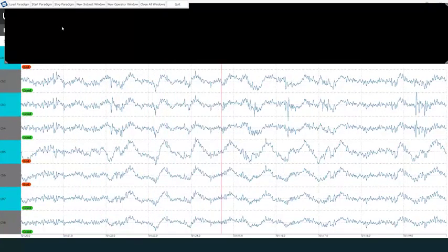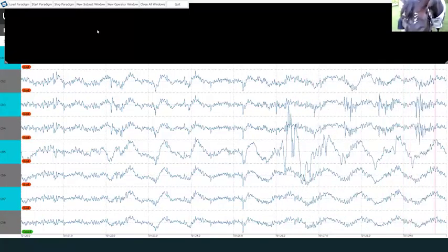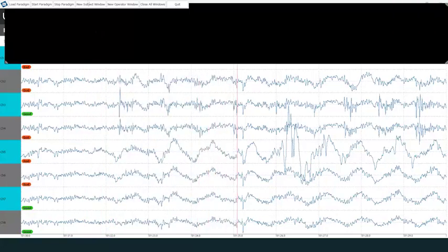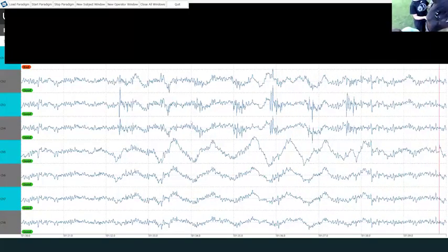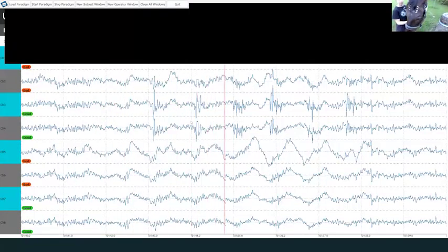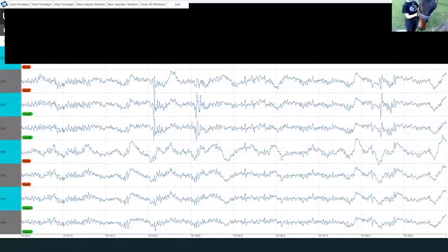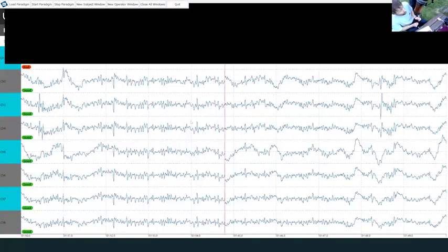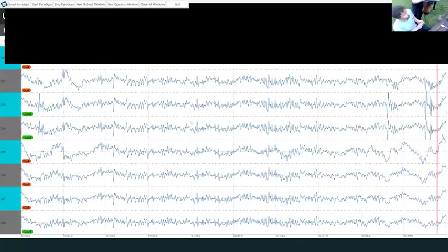So how come Trimi's EEG looks like human EEG? Basically, they are quite similar. When it comes to analysis, we have very similar behavior also of the auditory evoked potentials, and we have just somewhat higher amplitude components, which are probably from movement, especially with the ears, because we always place the electrode somewhere behind the ear, close to the ear, and in horses there's a lot of movement.